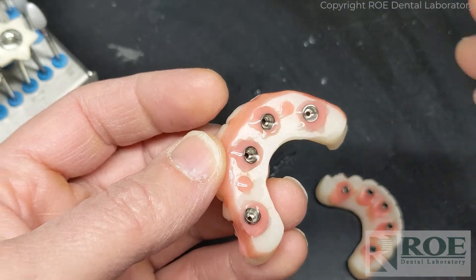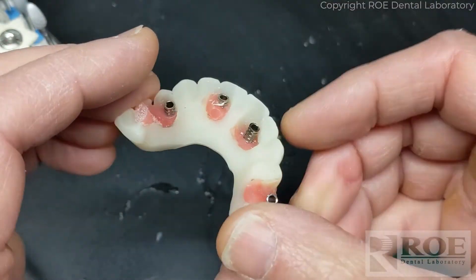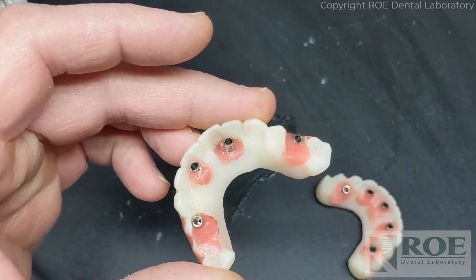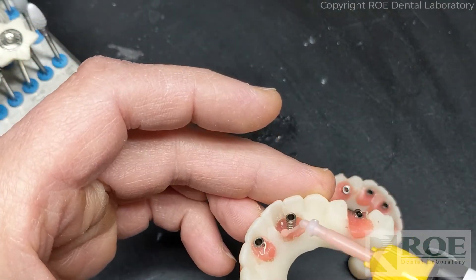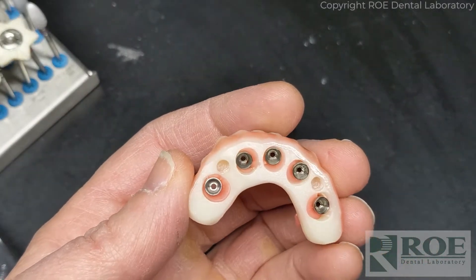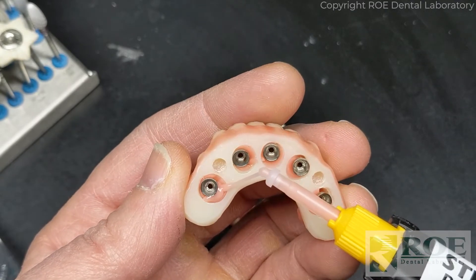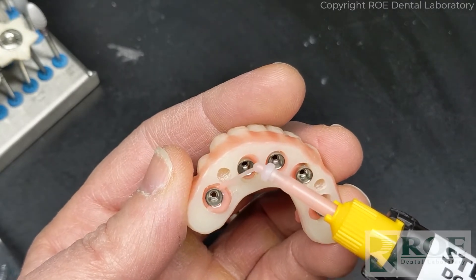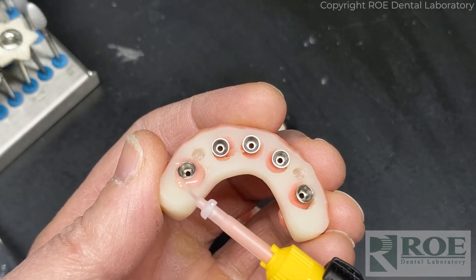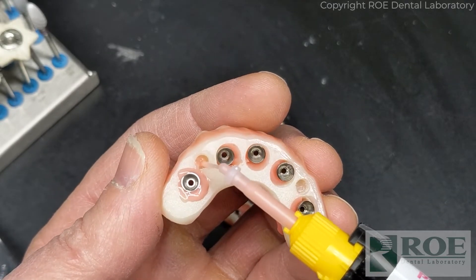Stellar tacks in about five seconds and full cure in about 20, so we'll just tack it. Now obviously the patient can't go home with this, so we will fill all of these voids. But before we do that, let's go ahead and do the lower since this tip can still be used - it's not set yet.